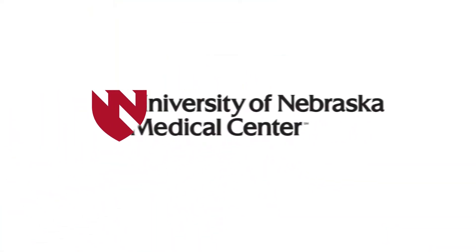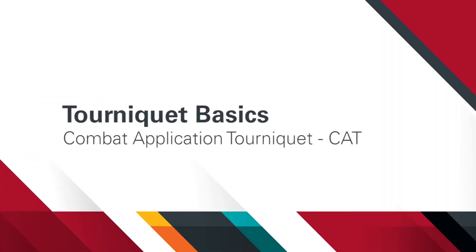In this video, we will demonstrate how to apply the combat application tourniquet, also known as CAT. The CAT can be used to control potential life-threatening bleeding.